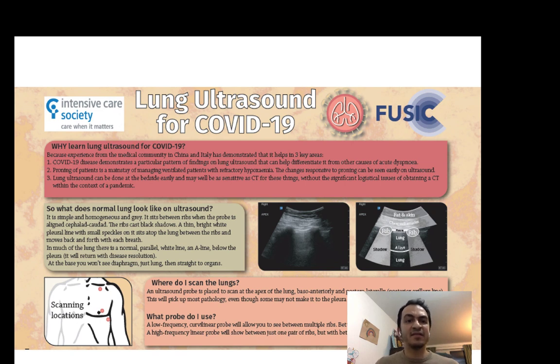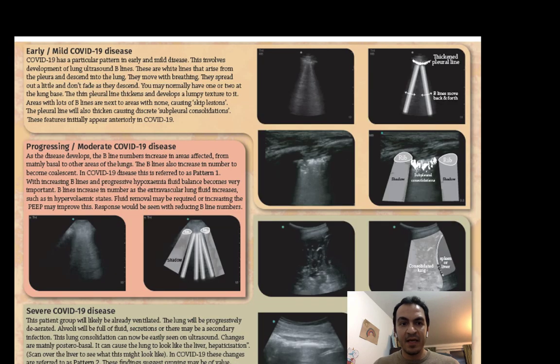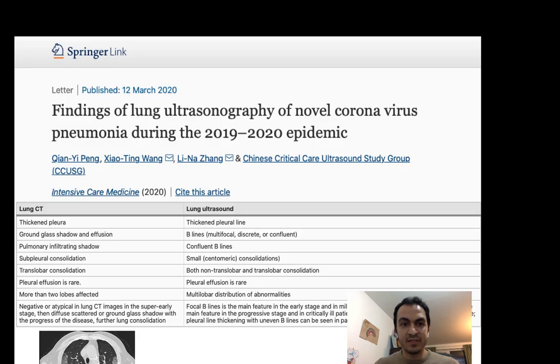And finally, this is another useful infographic developed also recently by the Intensive Care Society of the UK, which gives you simple and brief information about the utilization of lung ultrasound in patients with COVID-19. And this is an interesting study which was very recently published by the Chinese Critical Care Ultrasound Study Group.